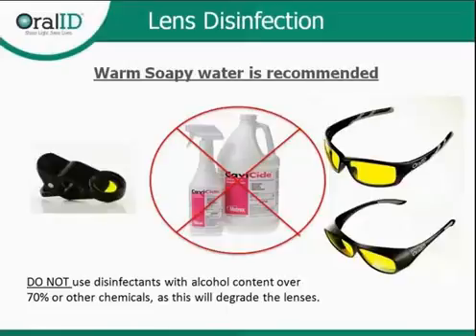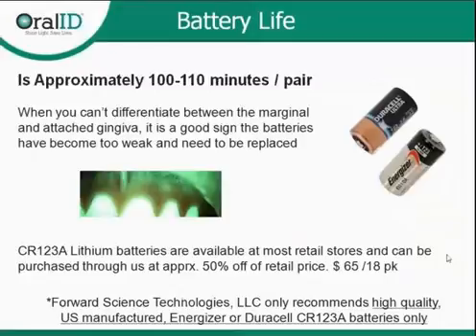The other set of glasses is designed a little bit larger, so if anybody in the office has existing eyewear, these are going to be the ones you tend to grab because they're going to actually fit over your glasses more comfortably. So that's why there's two different fits. The battery life lasts about 100 to 110 minutes.